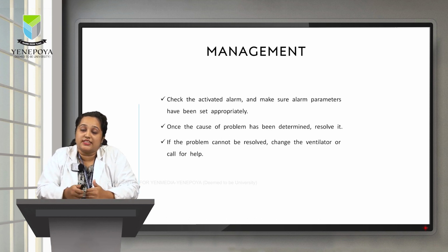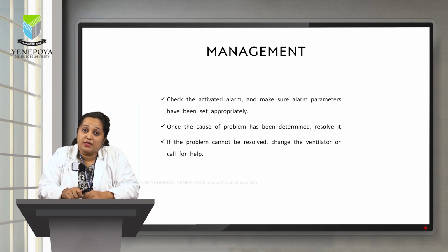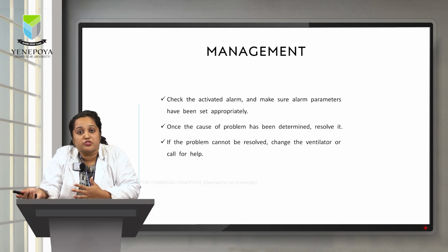Then once you have checked these things, the cause of the problem has to be determined. Like I told, you have to look at the patient and see what signs and symptoms are seen, or you have to do a good examination of the patient and see what causes can be determined. And once you know the problem, then you can easily find out how to troubleshoot this.